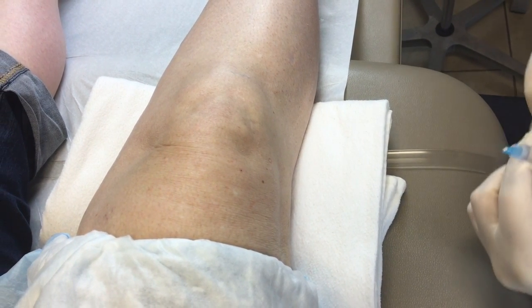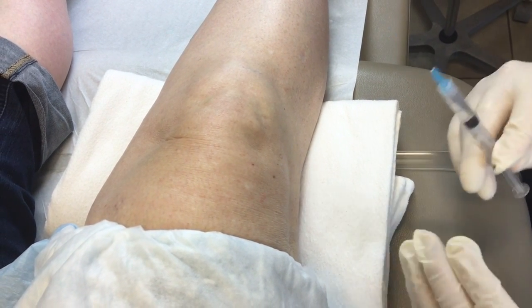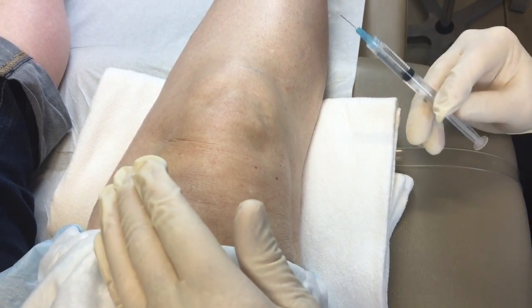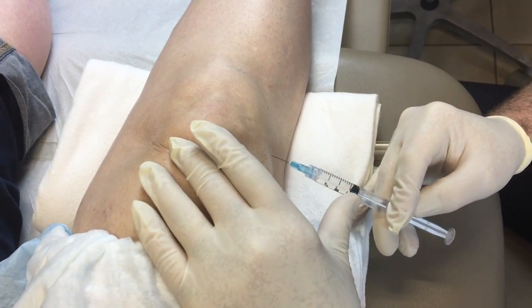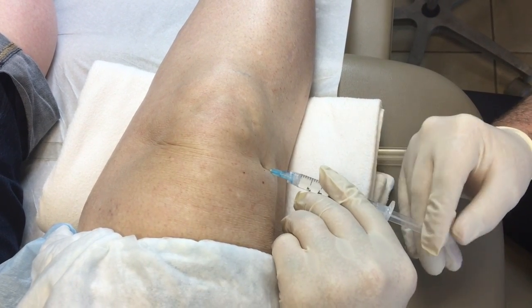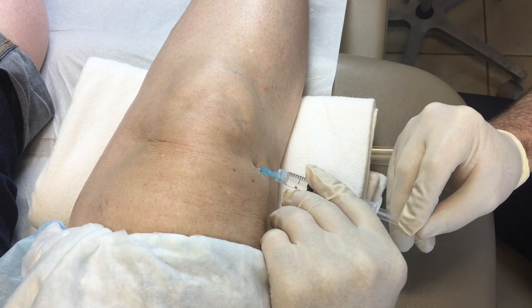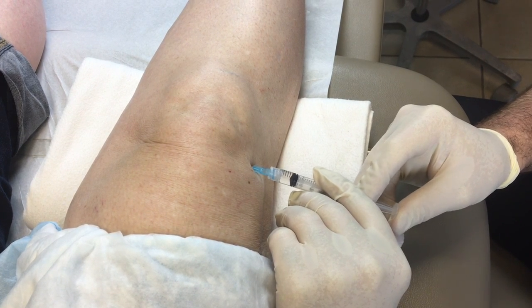For general residents who aren't as comfortable with this, this freezing step I would do for sure. Oftentimes I won't use any freezing because you're doing one single injection, but it's a good idea — if your position is off, you don't want to be messing around with the knee while the patient is uncomfortable. With the spot marked, I'm just going to inject a little bit of lidocaine here. When we're around joints, we don't use epinephrine.